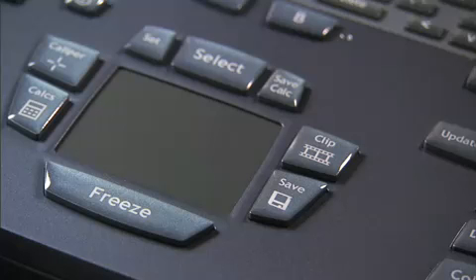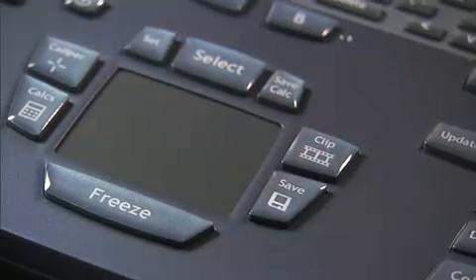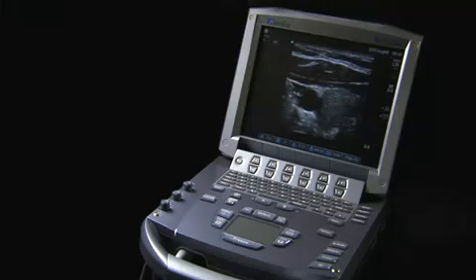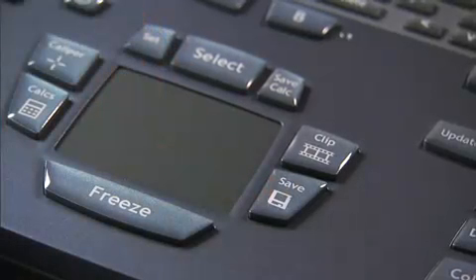On the right side of the touchpad, you have image storage options. Clip storage allows you to save a movie of the ultrasound image — a clip length from 2 to 60 seconds may be captured. The Save button allows you to save an image or clip to the internal storage on the system.